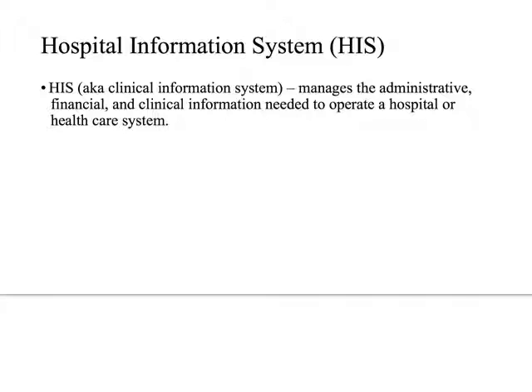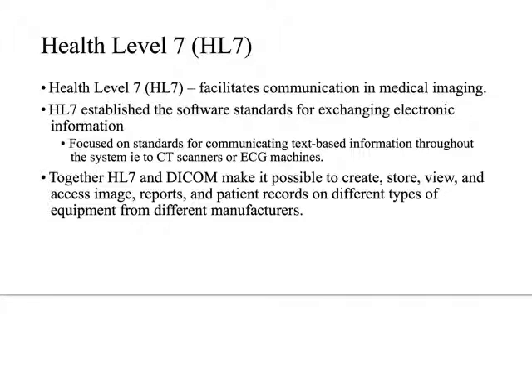So HIS is just the Hospital Information System, sometimes called a Clinical Information System, and this is going to be what manages the administrative, financial, and clinical information needed to operate a hospital or healthcare system. A lot of times it's embedded in the EMR, but it has separate allowances from the EMR, because if you just need to access a patient's chart, that's one thing. If you want to control how billing works or something like that, there needs to be some permissions and different kinds of access points.